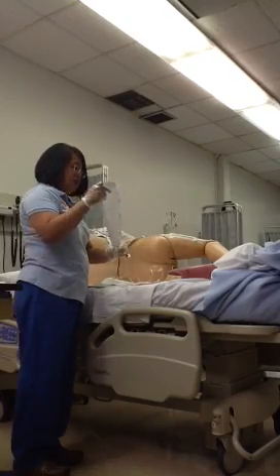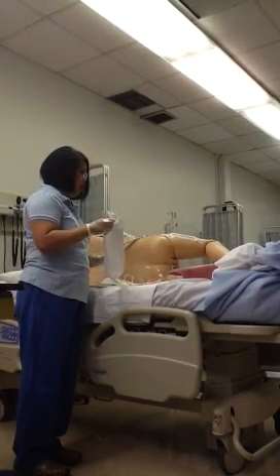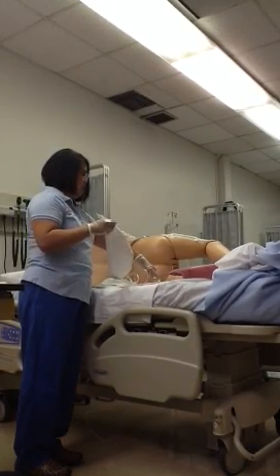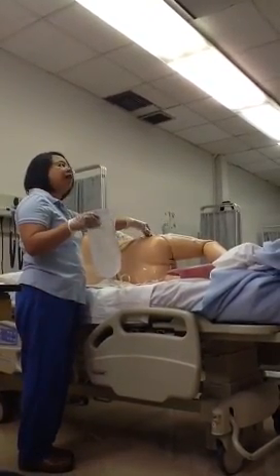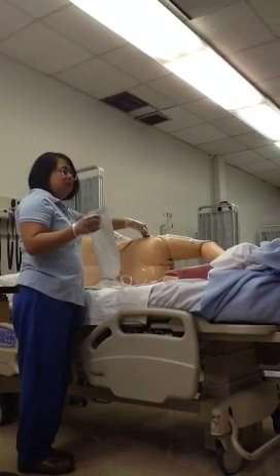You're going to put this bag at hip level at first. Hip level. Okay? You're going to unclamp. And then you're going to let this water, warm, soapy water, flow. Okay? Now, he is probably going to feel that warm water.